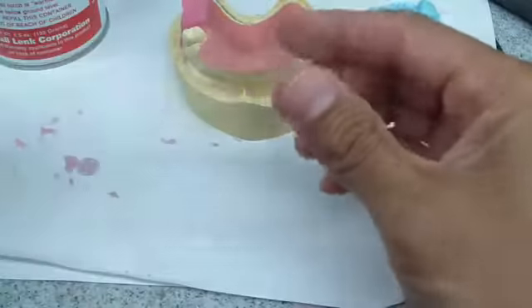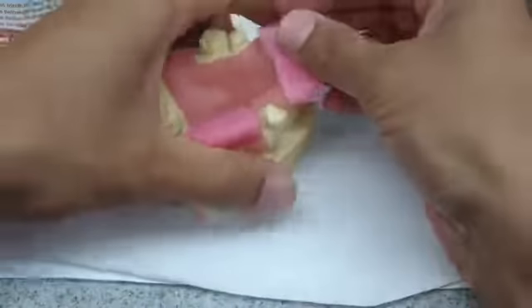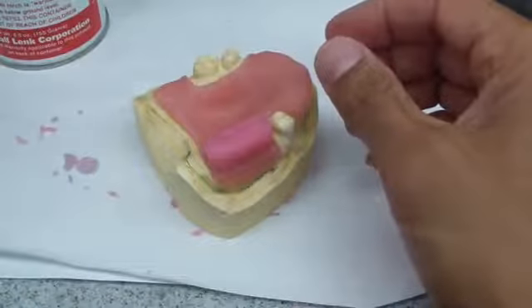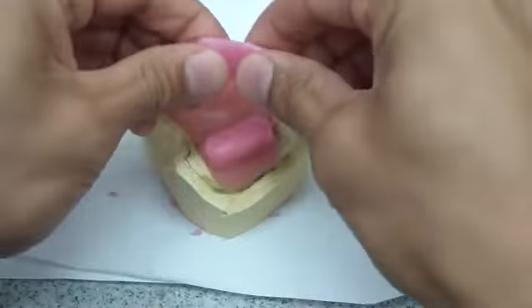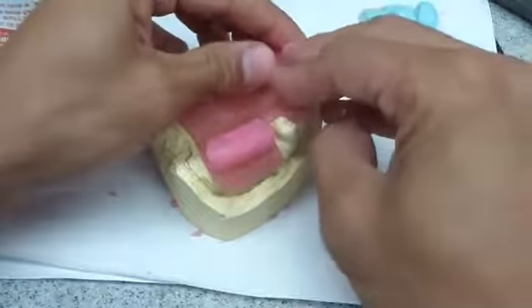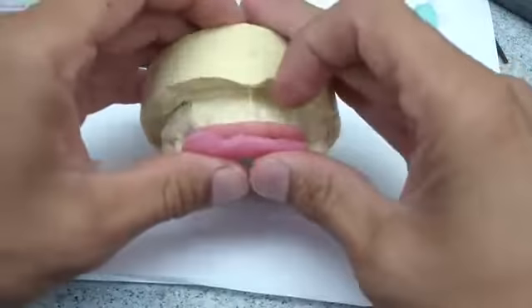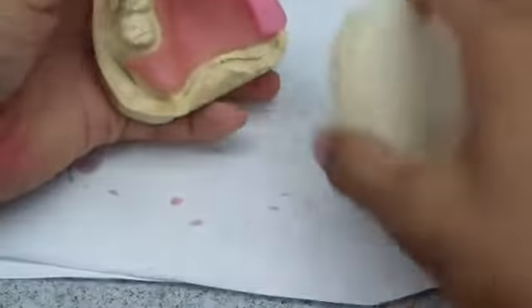Goes together. And I'm sort of just guesstimating how much I'm going to need.